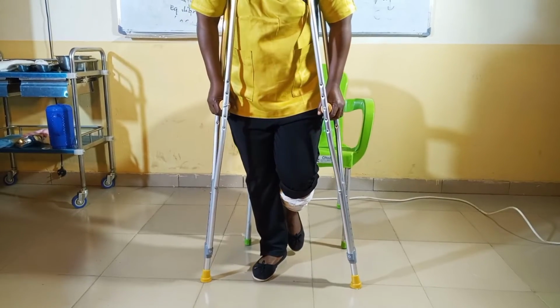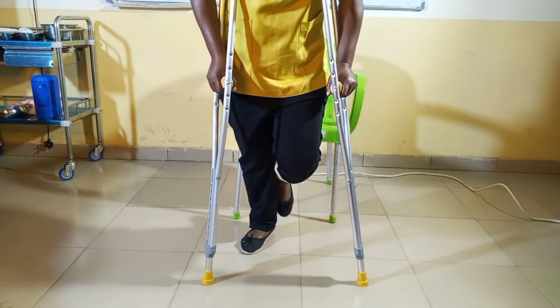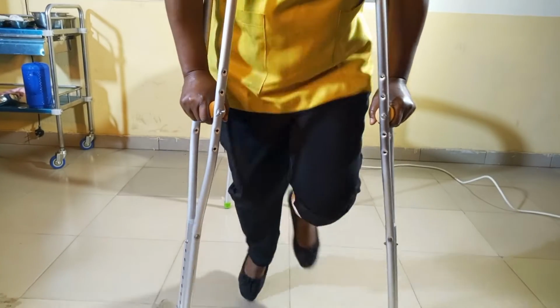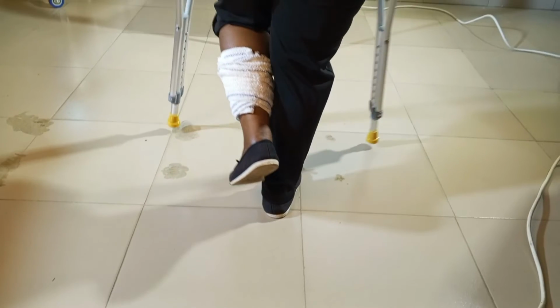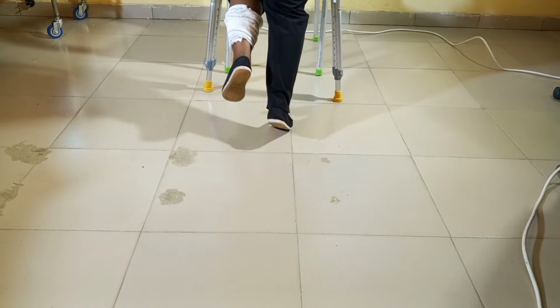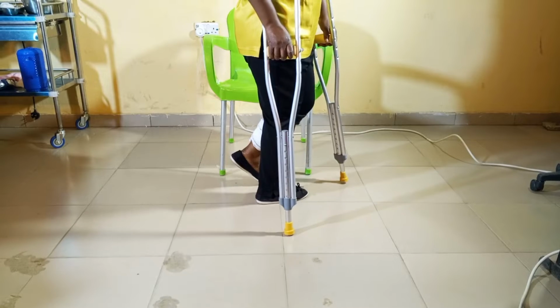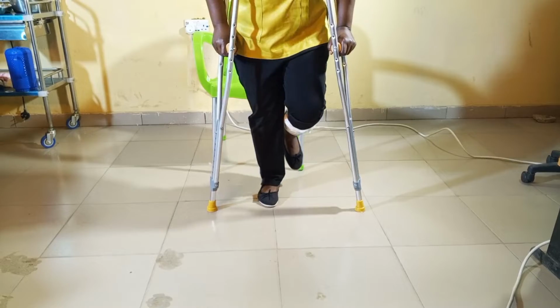Now like this, since we are doing no weight bearing, push the crutches forward a bit and then you jump, right? And push the next step and then you jump. Remember, it's no weight bearing, right? Then you turn. Make sure that there is no weight on the affected limb, right? No weight at all. And while turning, be careful so that you will not injure yourself. You turn properly, right?